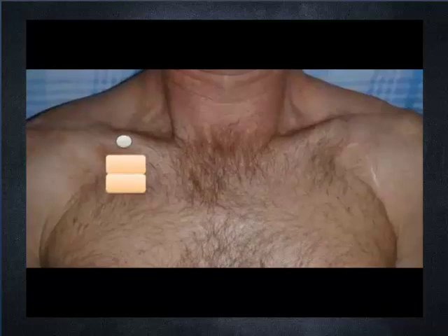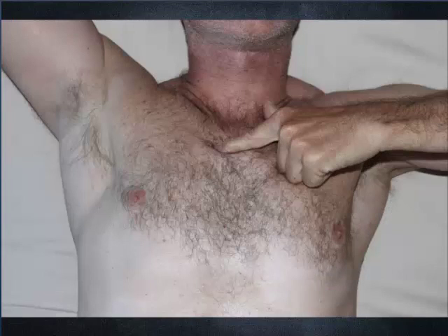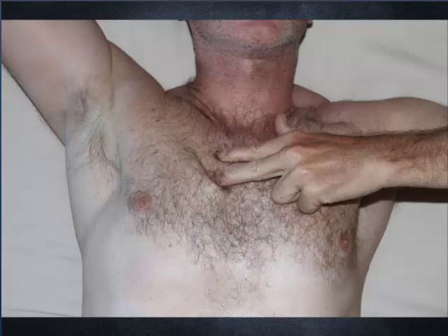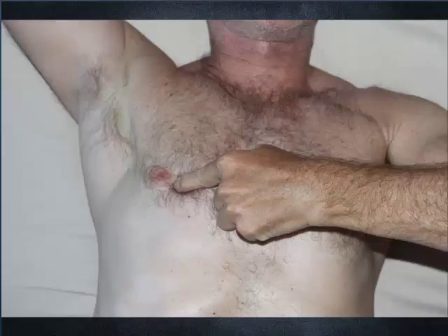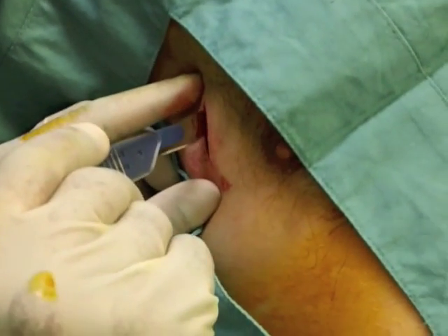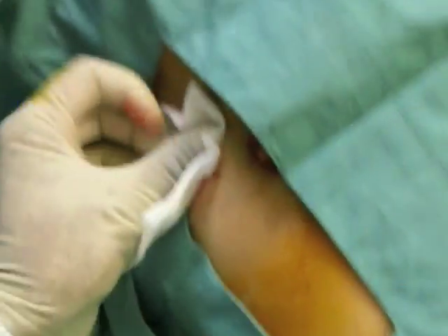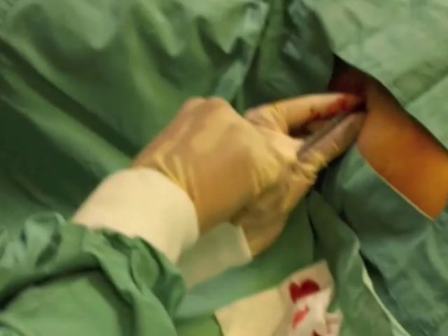The urgent thoracostomy is done in the fifth intercostal space at the anterior axillary line. We find the fifth space by counting down from the second intercostal space — which is the first one you feel — then three, four, five. In the obese you can usually get a close guess. It is done by cutting down through the skin and soft tissue and pushing through the intercostal muscle with large curved forceps.